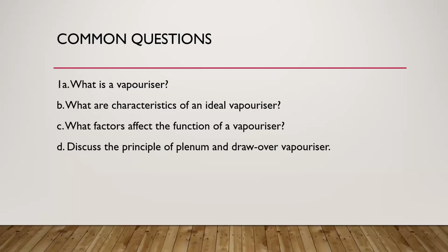Changes in pressure. Altitude, I like that. When there's a crack or breakage in the rotameter. Yes, when there is a breakage in the flow meter.